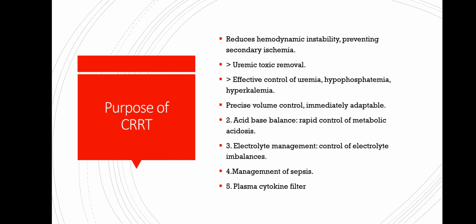Another purpose of CRRT is acid-base balance, with rapid control of metabolic acidosis. Then electrolyte management, control of electrolyte imbalance, management of sepsis, and plasma cytokine filters.